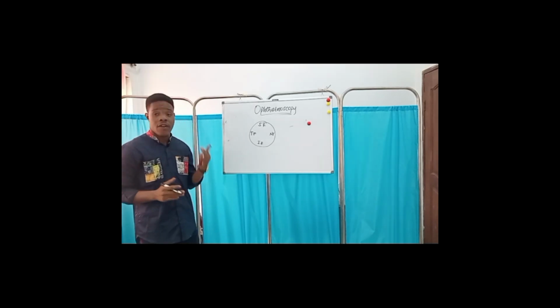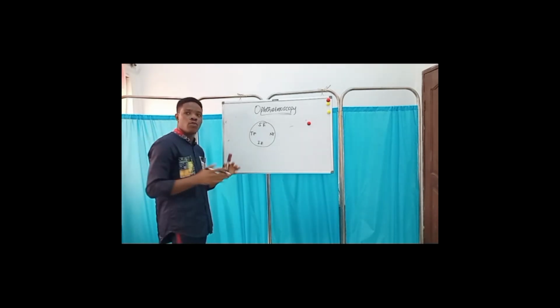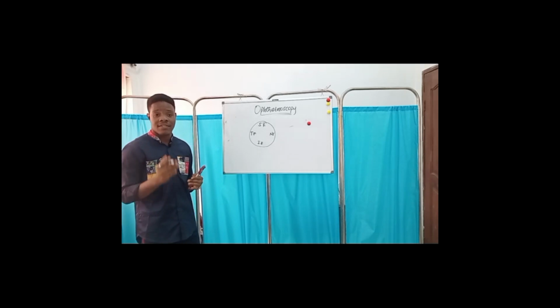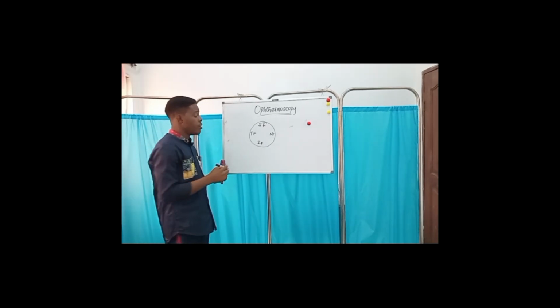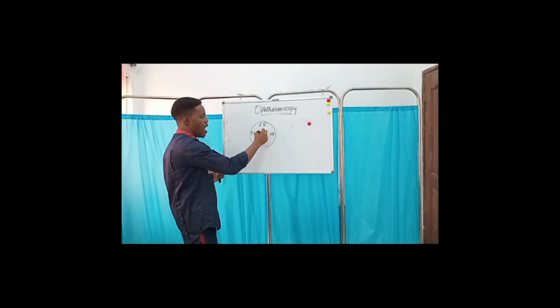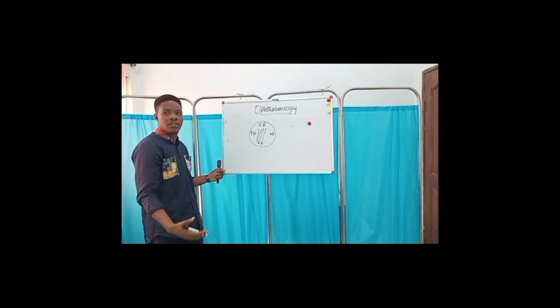We also want to look for fibrosis, make sure there is no fibrosis. Also, we are looking for soft exudates and hard exudates. Remember, soft exudates and hard exudates are signs we see in diabetic retinopathy, so we want to rule that out. We're also looking at tessellation of the fundus. So you see a black and red stretching all over the fundus. That is what we call tessellation.